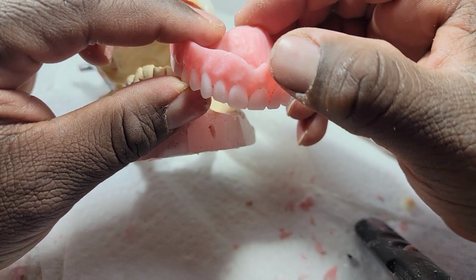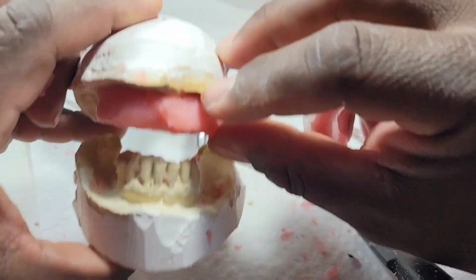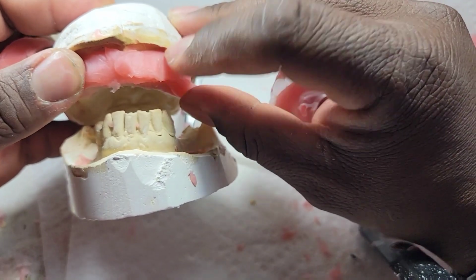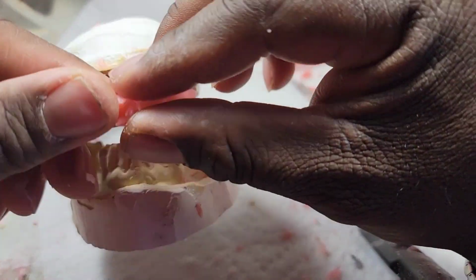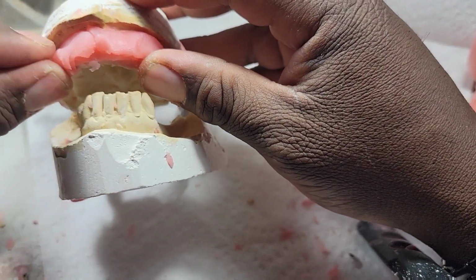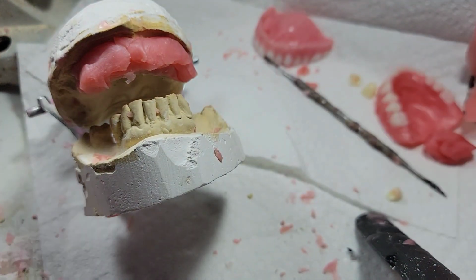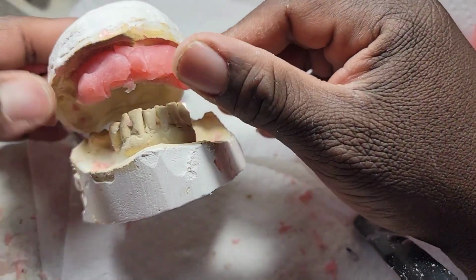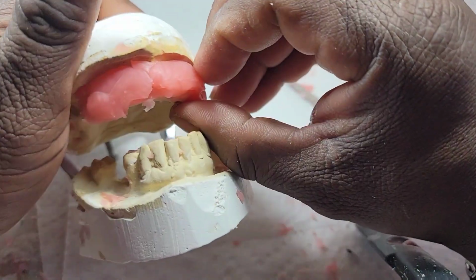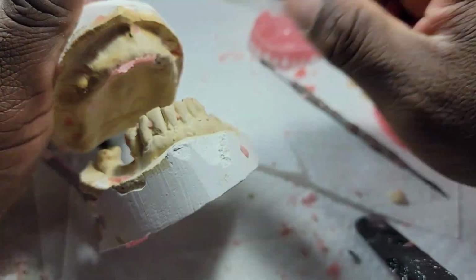People sometimes want it built up. But what happens? That thickens your denture too. When you ask for this to be built, you want lip support, you want to hide those wrinkles, you're compromising the weight of your denture, the fit of your denture, and the comfort of your denture when you want that lip support happening. That also happens with people asking for requests. Sometimes the dentist has to talk them out of it. Lip support's not good, you don't have enough bone for it, and so on.